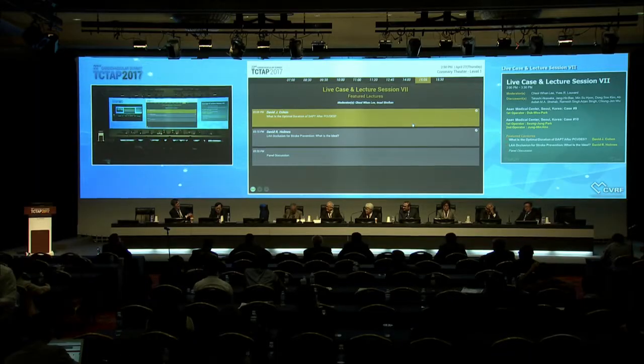In my lab, we have right radial dominant and left radial dominant operators, so it doesn't matter for me. It's only that left radial probably increases radiation somewhat, so we have to negotiate. But right now I've modified my approach with Dr. Kimenage. He moves the patient's hand on top of the groin, and we can puncture from there. Equipment is becoming slender and slender.